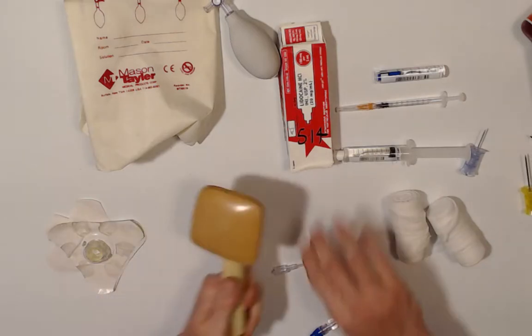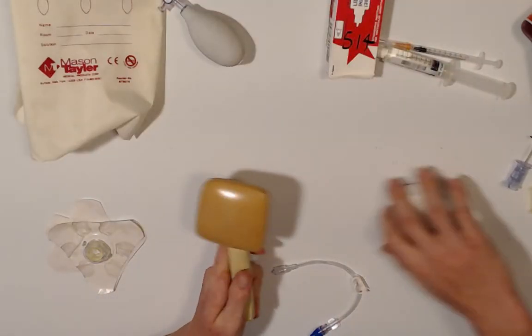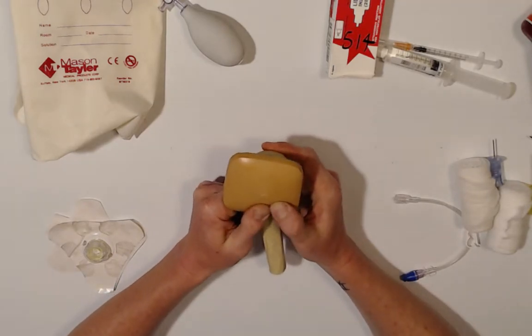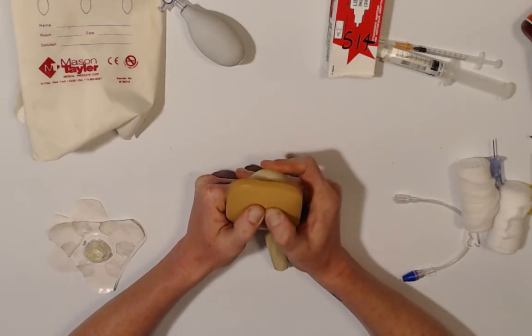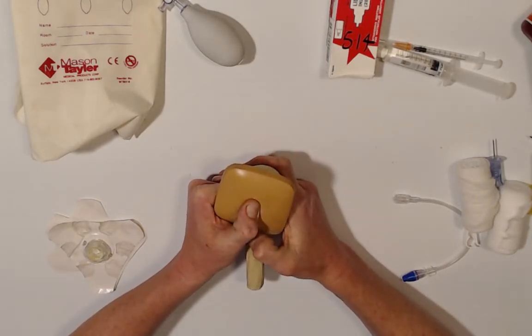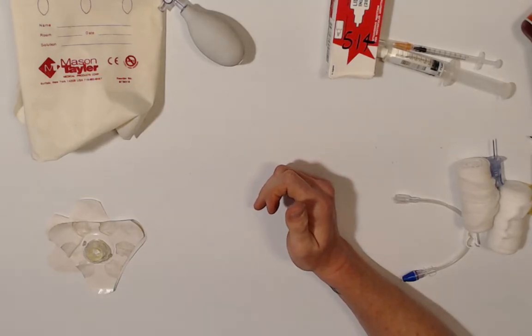So that was the humerus. Like I said, we're going to palpate, find the flat part of that humerus, walk our way up until we feel the ball and that most protruding part of that humeral head. That's where we want to go at a 45-degree angle.